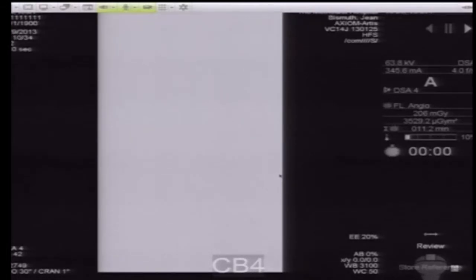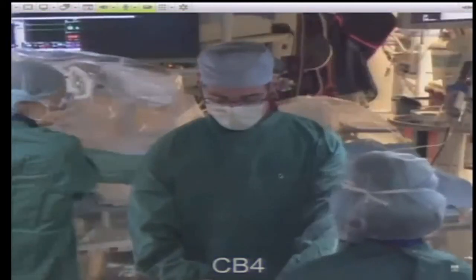What he's talking about is the kind of balloon he's going to use to dilate this up. What you're looking at here going down into the foot is the artery — we like to see continuous flow coming all the way down to the foot. That's the ankle joint. The way these X-rays are shot is what's called digital subtraction angiography: it takes a picture, then we inject dye. The computer subtracts the original image from the secondary image, giving us really good pictures of the blood vessels themselves, with the silhouette of bone remaining in the background so we have some idea of where we are.